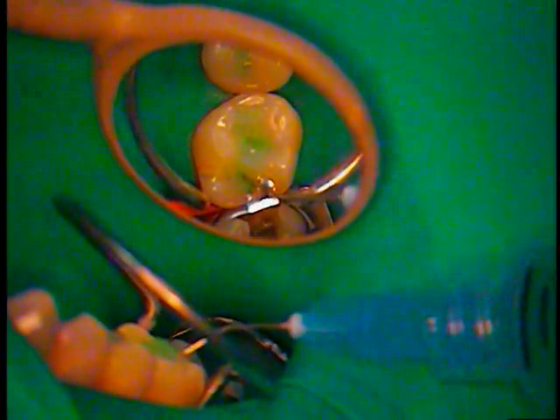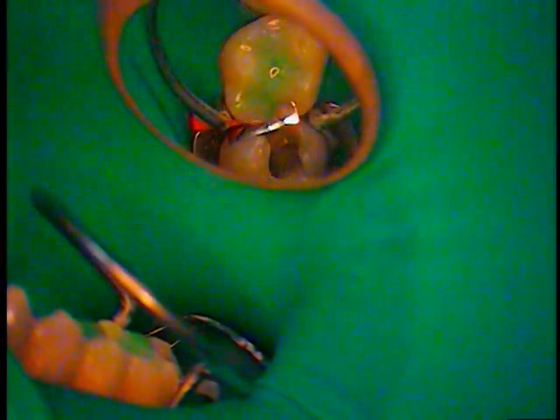Okay, we'll start up in here, here, here, a couple of spots in here that we did. Okay, let's do these two and then we'll rinse these two first, and then I'll do the large one back there. We'll seal them all together, got a nice seal. The rubber dam looks, everything looks great. How you doing? Okay, great.